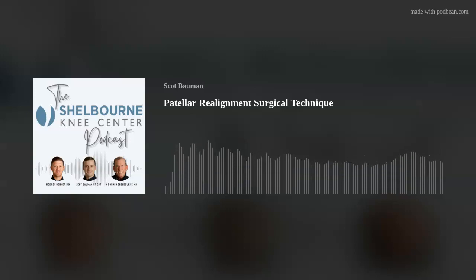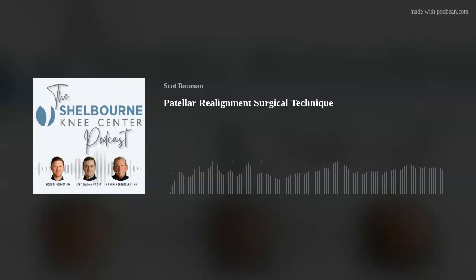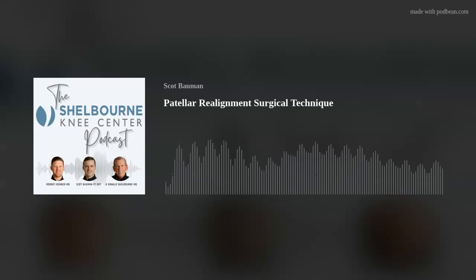And I also do this with an osteotome. I don't do it with a saw. I dissect down on the lateral side of the tibial tubercle and outline the lateral edge of the tibial tubercle and go all the way up to the more proximal extent of the tibial tubercle where the patella tendon inserts, and there's a small bursa between the tendon and the bone. I always make sure to get my finger between the tendon and bone and put an Army Navy retractor in that area so I can see the attachment site really clearly, and then use a broad flat osteotome to create a centimeter thick and about 6 centimeter long osteotomy. At the very end, we can start to taper it out, so you don't have to have a sharp edge there at the end where it's at a 90-degree angle.